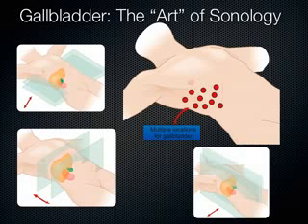And I mean, I found the gallbladder all over the place, and sometimes in older patients, everything kind of sags down. I can see it down here. I found the gallbladder over here before in an older lady. So, I mean, this is generally speaking all the different locations you can dig around and find it.